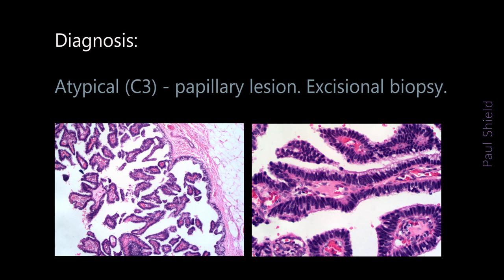So papillary lesions in the breast are seen in papilloma, atypical papilloma, fibrocystic change of multiple small papillomas, and in papillary carcinoma. Although often, as was the case in this case, the cytology is quite benign looking, like a papilloma, it's unreliable in excluding more worrying neoplasm. Sometimes these can appear quite benign, but show areas of carcinoma in situ. On the other hand, infarcted papillomas can present quite a worrying picture with loss of cohesion, nasty background, sometimes some atypia.